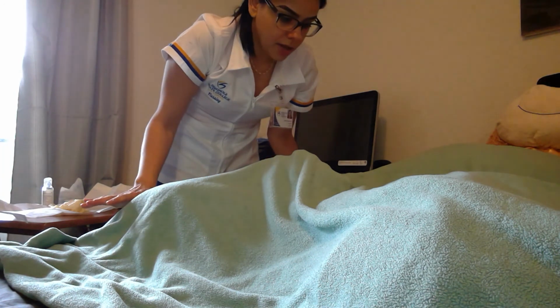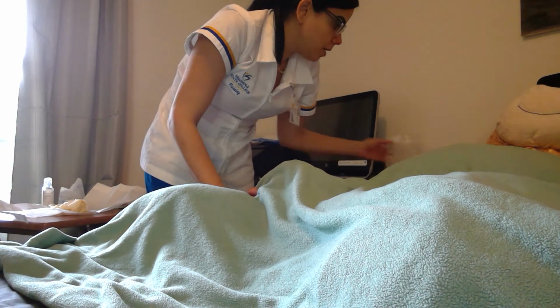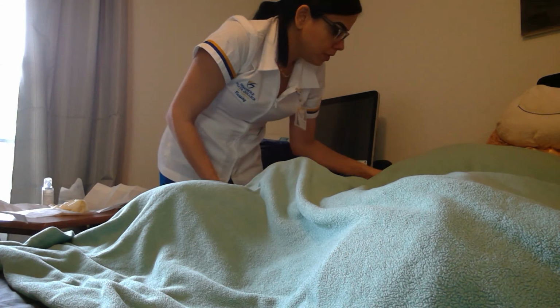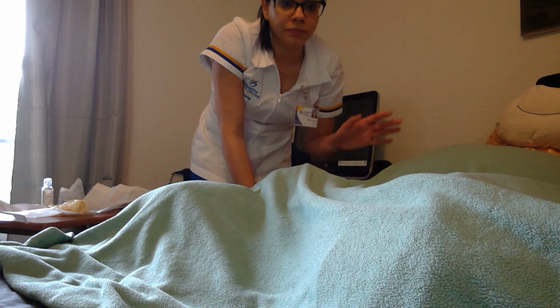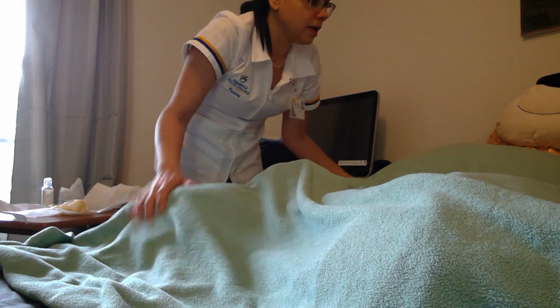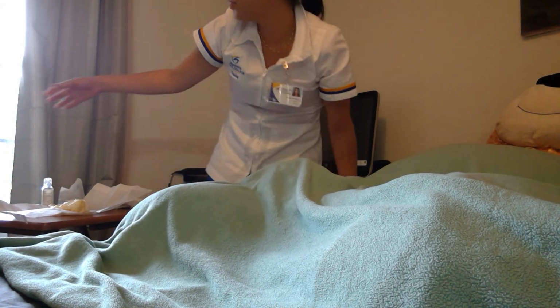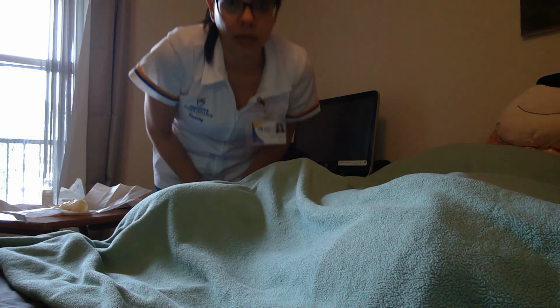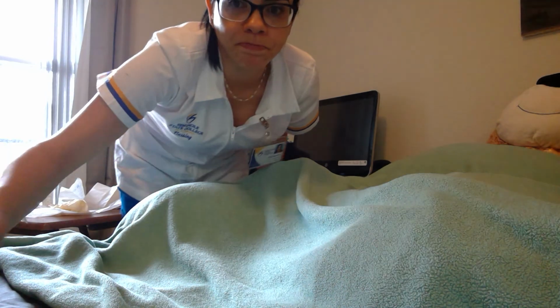You want to lower the bed, make sure your patient is comfortable, make sure she's not in pain. Like I said, get rid of all of your trash. Put the rails up, her call light within reach. Make sure her room is safe, and if she has any questions, you can answer her questions, and if not, then you would open the curtain, open the door, and leave, and check on her frequently. So that was it. Thank you.